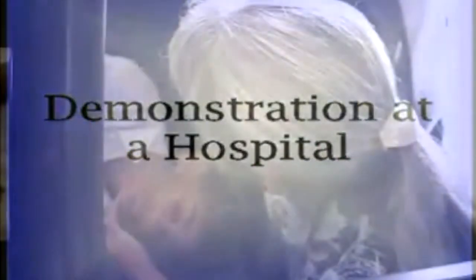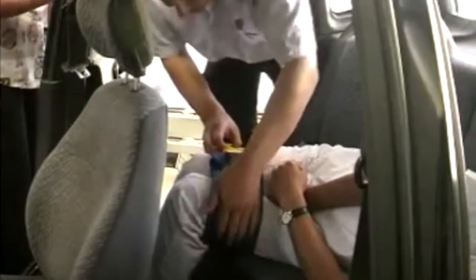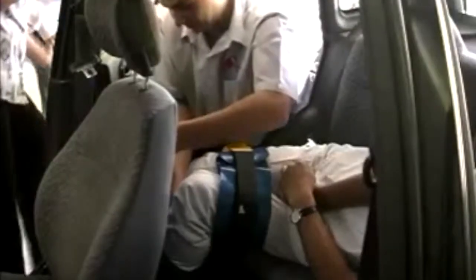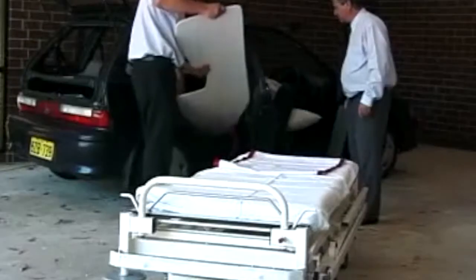In an emergency situation, the first thing to do is check the patient and make sure it is safe to move them. Lower all the car windows to keep it cool and allow access if necessary. The straps are then put onto the patient, preparing them for evacuation from the vehicle. Good back care practices should be used, so remember to bend your knees and not your back.